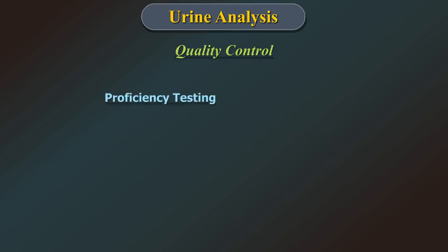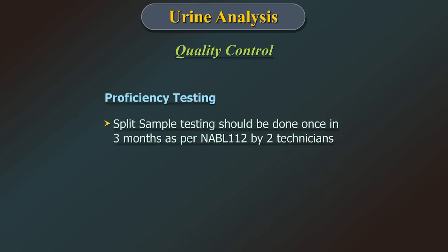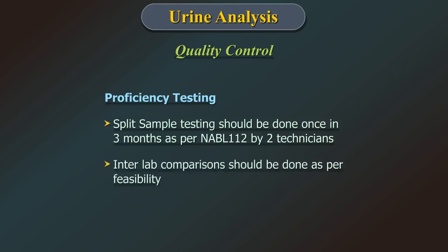Proficiency testing. Split sample testing should be done once in 3 months by 2 technicians as per NABL 112. Inter-lab comparisons should be done as per feasibility.